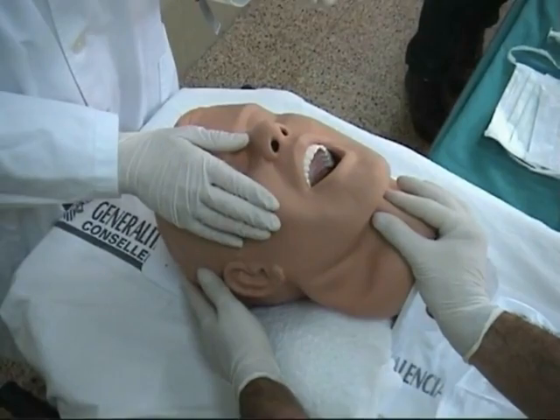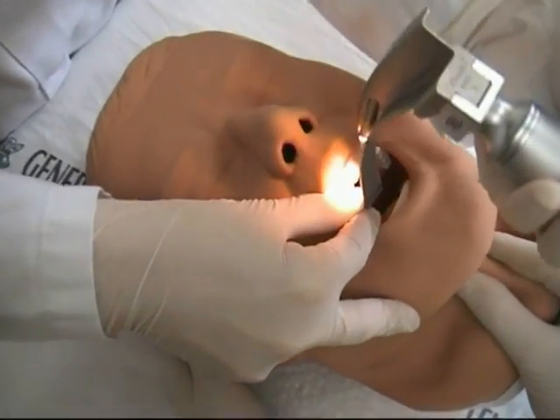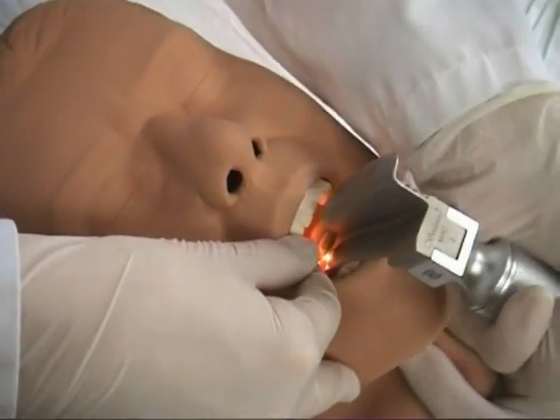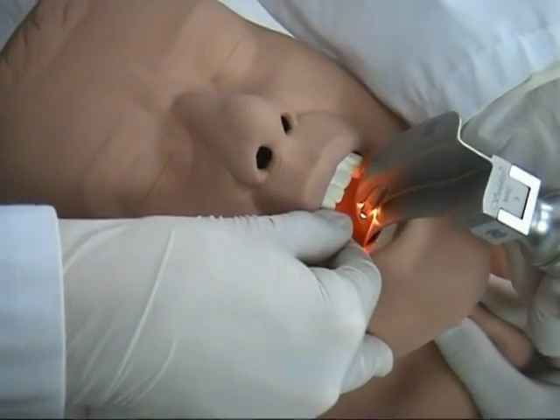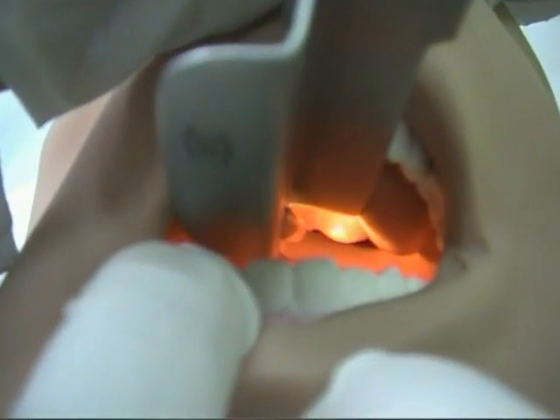Hold the laryngoscope with your left hand, blade down. Open the patient's mouth with your right hand and gently insert the laryngoscope blade into the right side of the patient's mouth and gradually move the tongue to the left to expose the epiglottis. Advance the laryngoscope blade to visualize the epiglottis. Put the tip of the laryngoscope blade into the vallecula.